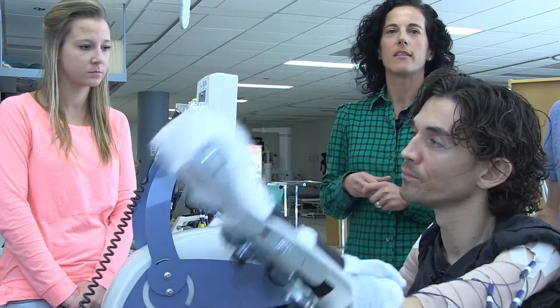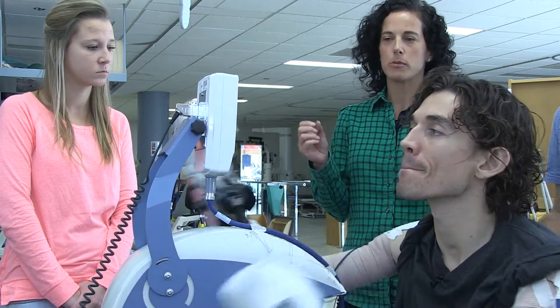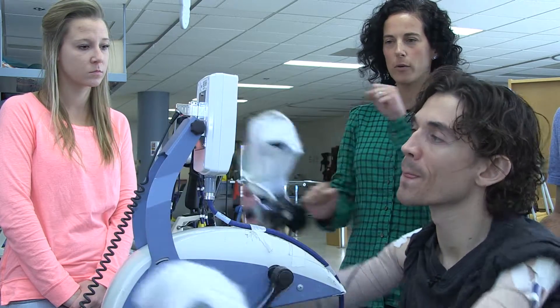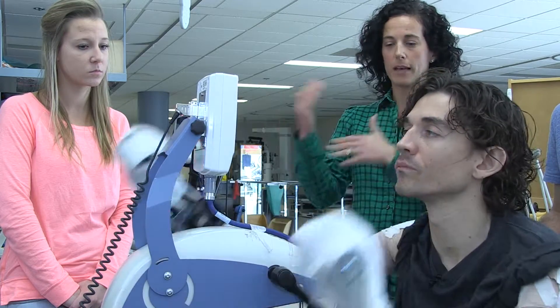The targeted muscles that we're stimulating work together to produce a functional motion, which with this machine is cycling. Dan can either cycle forward or backwards, and the programming allows him to do that.